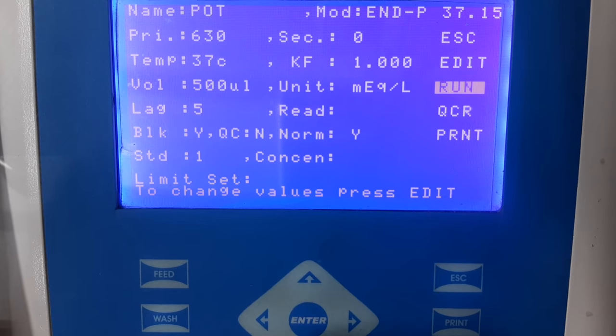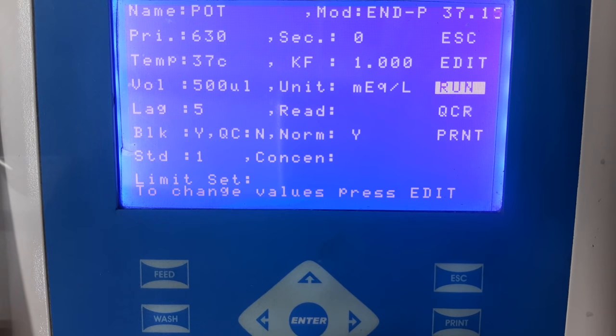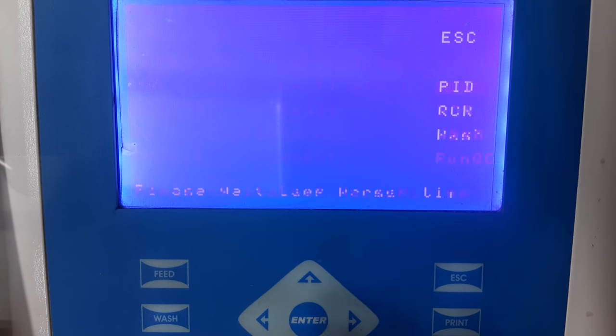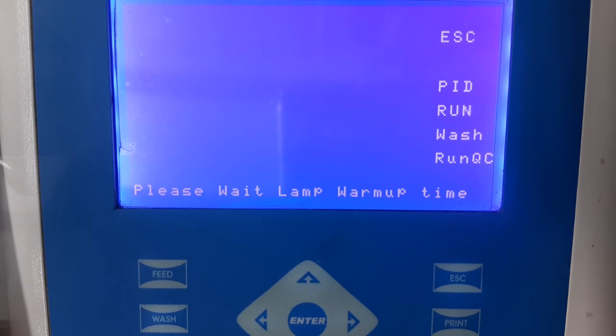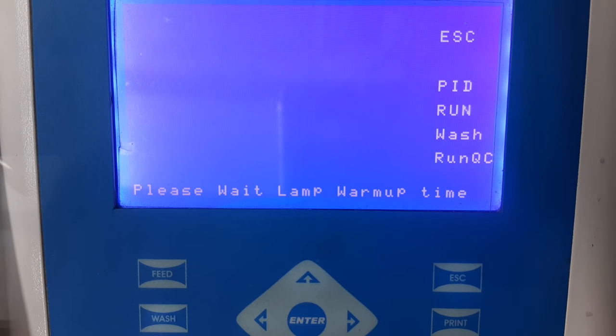If you wish to run any patient sample, select the run option and the instrument will guide you on how to take the absorbance. Thank you, and we hope this video has been helpful for you.